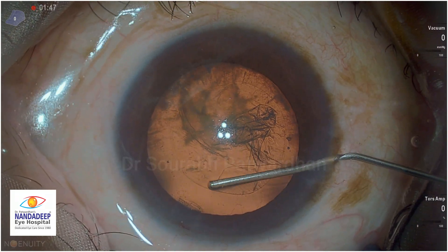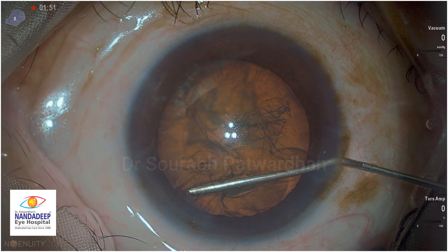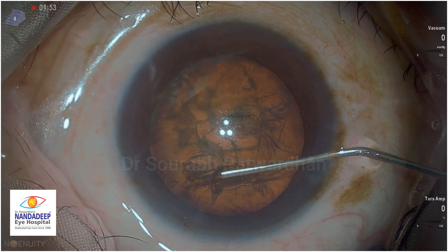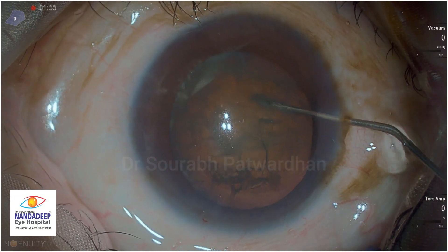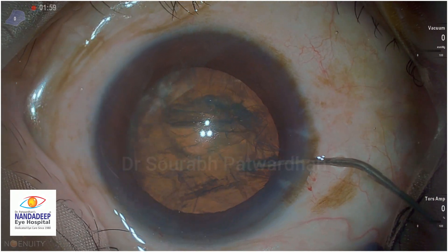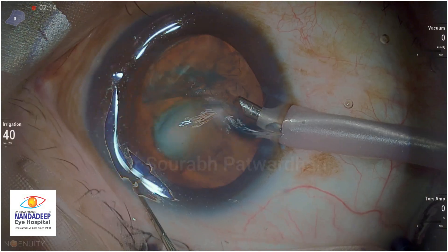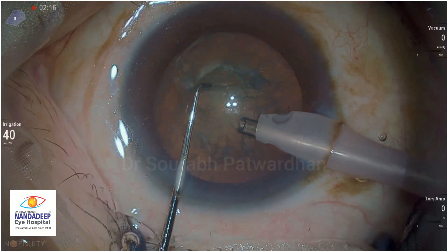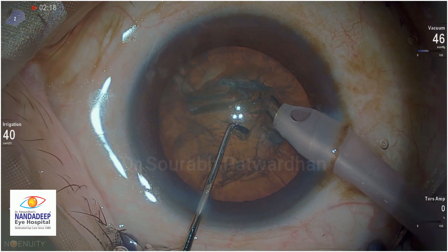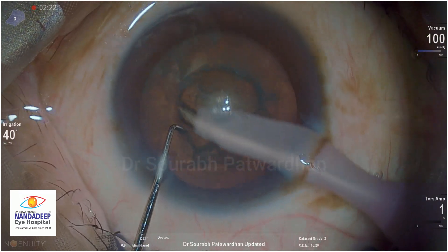Don't get into those troubles. Hydrodissection is very important. You can see the position of the cannula is most important at the equator, and then push the fluid with some force and you can see the wave passing to the other side. Tap on the other side so that you get a very easy rotation of the nucleus. It is a soft cataract, but when I did hydrodissection, I also sensed it is not very soft - it is grade 1.